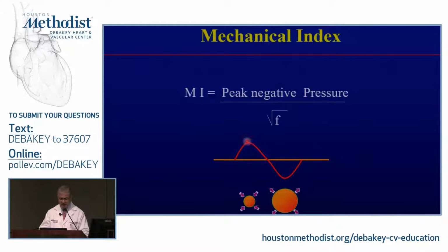And remember, ultrasound is characterized by waves of high pressure, low pressure, high pressure, low pressure. So if you're talking about insonation of these tiny microbubbles, at the high pressure they're going to be compressed, and at the low pressure they're going to expand. And what happens with them? Obviously, it is not the high pressure that is destructive, it is the low pressure that expands and basically breaks that little membrane that you have around.